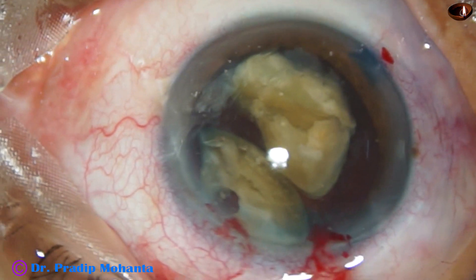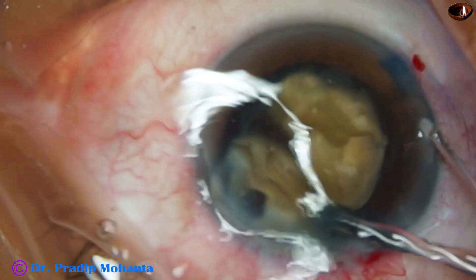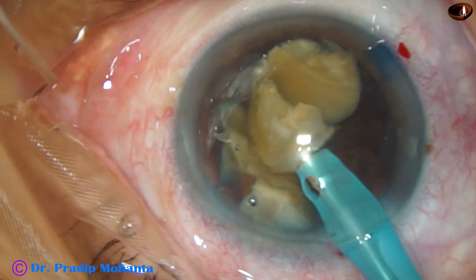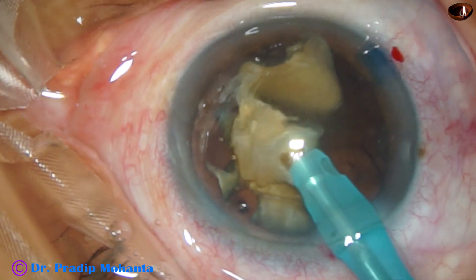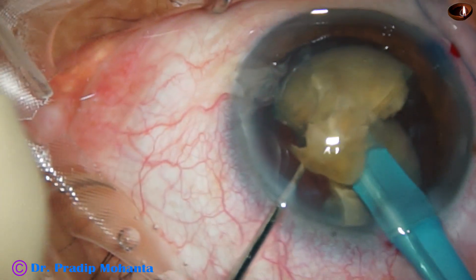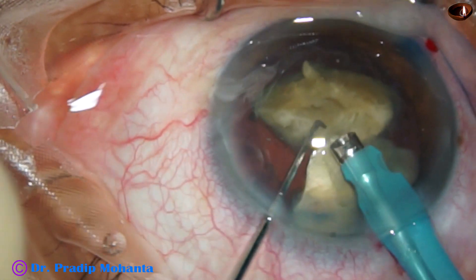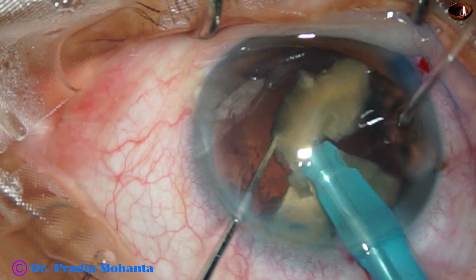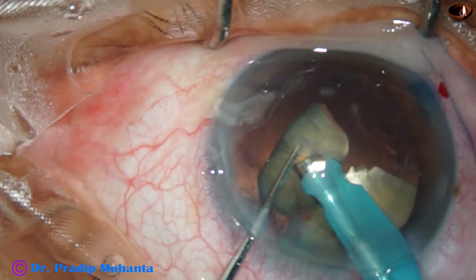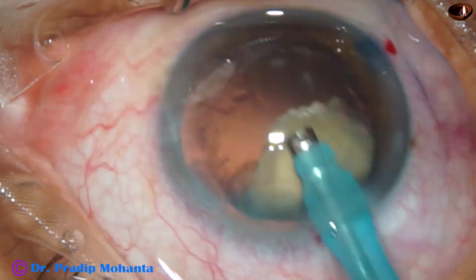Now I inject visco again. The pieces have actually come forward, so I have to hold the nuclear pieces and, holding them, go back to the iris plane and emulsify the fragments. But this free fragment was actually rubbing the corneal endothelium, and this should not occur. However, in the postoperative period, the patient was doing well. There was mild central corneal edema, but otherwise the patient did very well.